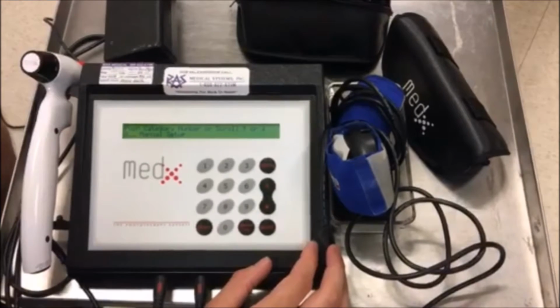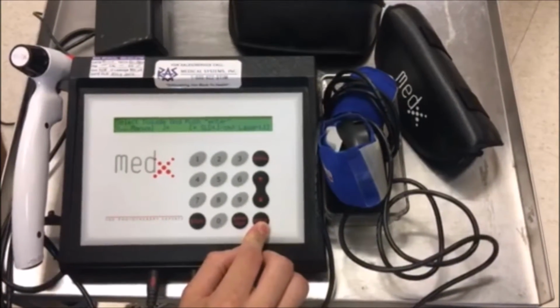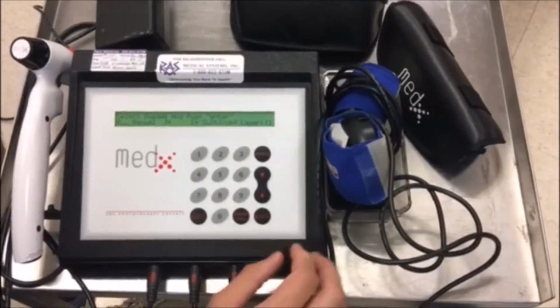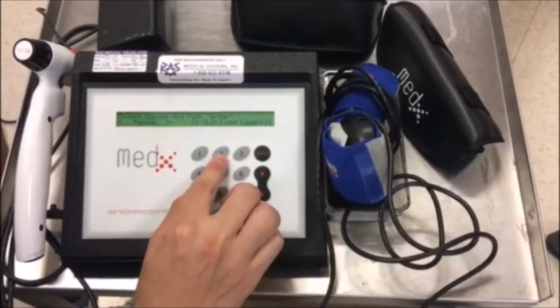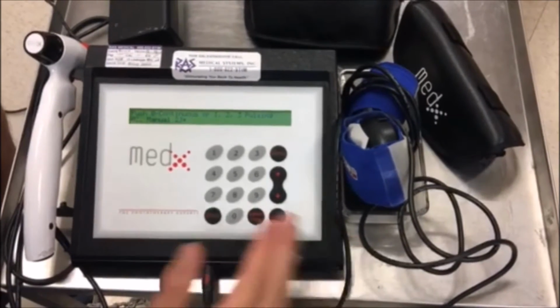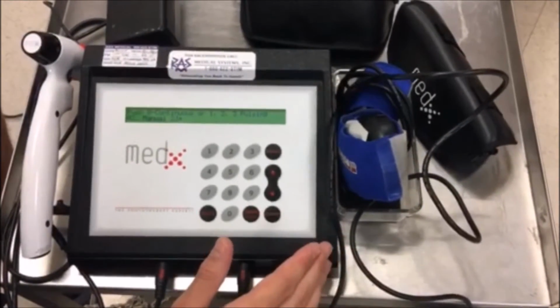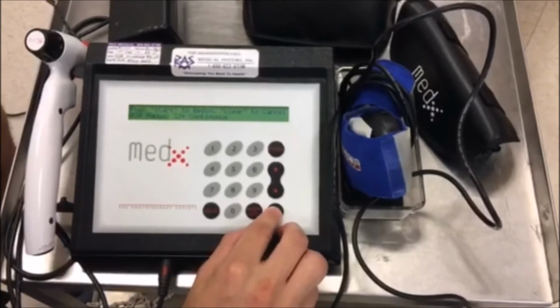Because we're great clinicians and we understand what amount of joules to use for various pathologies, we're going to check manual. Depending on what pathology we have, we can enter the number of joules required to treat that pathology. For example, if we are treating an acute arthritic condition, our joules would be set between 2 and 4. Just for safety's sake, we start on the low end, we enter 2, and then we press enter. Now we're prompted to choose either continuous pulse or a pulse with interruptions in between. We want to start with continuous, and if the patient feels discomfort, we can switch to pulsed. So we'll push 0 for continuous, and then we will press start.